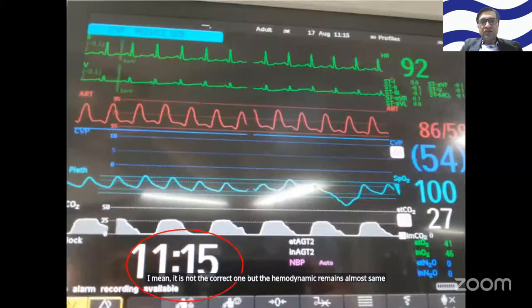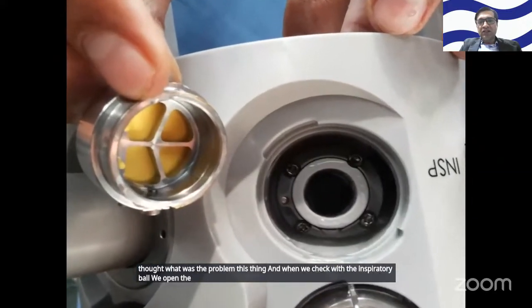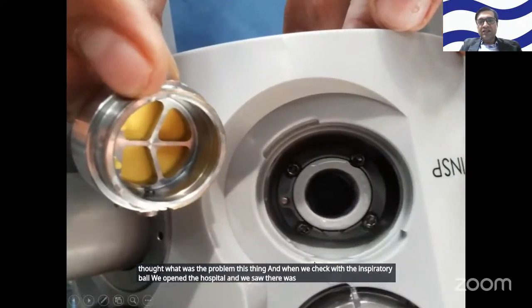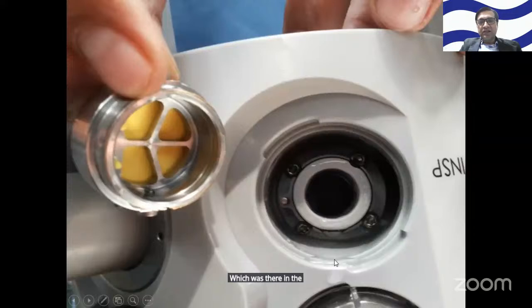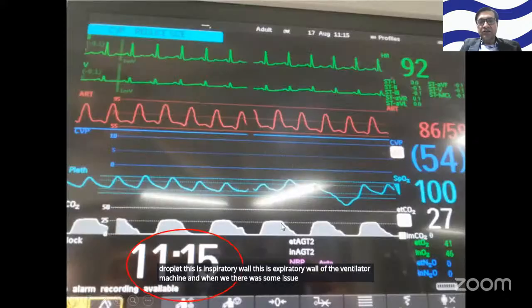So we thought, what was the problem? When we checked the inspiratory valve, we opened it and saw some water droplets in the inspiratory valve. This is the inspiratory valve, and this is the expiratory valve of the ventilator machine. There was some issue happening at phase 4, so something was happening at the inspiratory level.